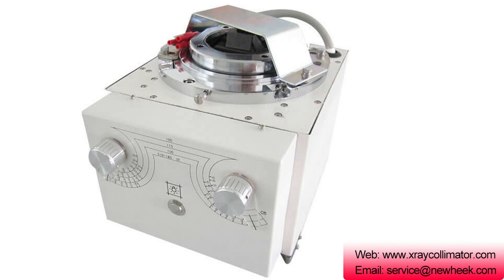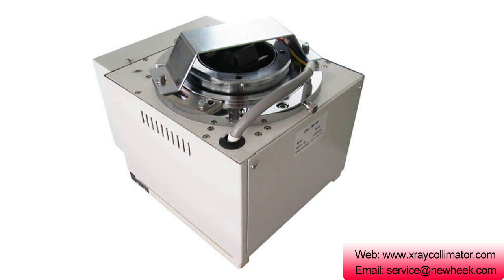Nuheek X-ray collimator meets industry production standards. Nuheek offers a wide range of collimators for radiographic, fluoroscopy, vascular, and cardiovascular applications to meet individual customer needs. In addition, in order to meet customer requirements, we also provide a collimator with lead lights.